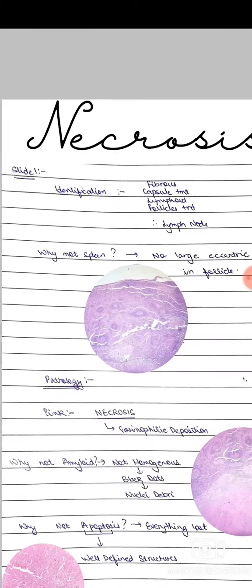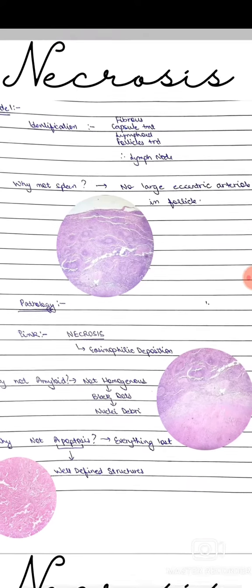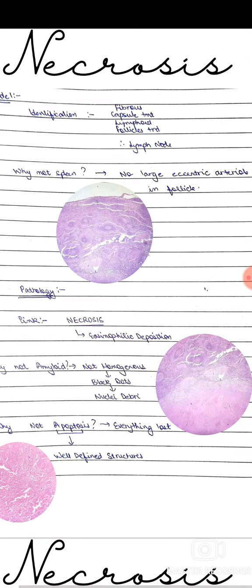But why is it not the spleen? Because there is no large eccentric artery in the follicle. So now, to identify the pathology, we go somewhat further down.